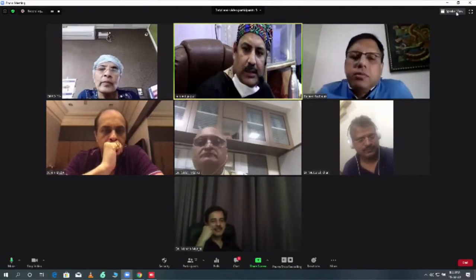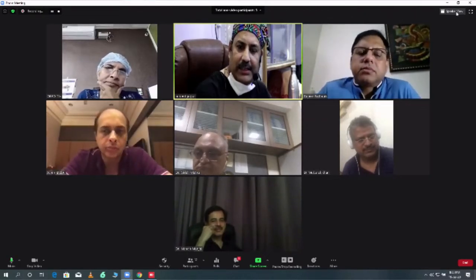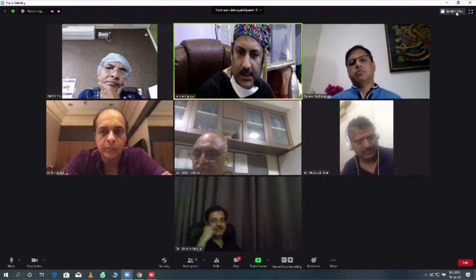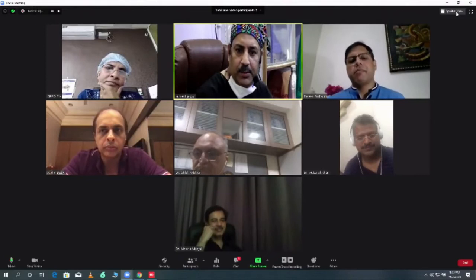Even a junior-most guy can do it with the same efficiency as a senior-most guy like Ashim is doing with the Teflon. That is the beauty. It is making life simple. That's true, no doubt. That's the beauty of the tool.